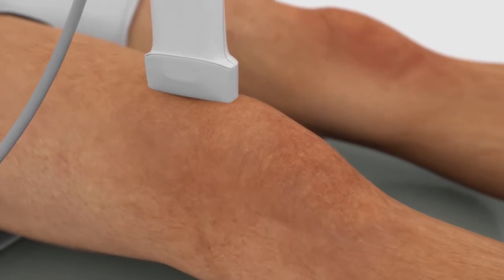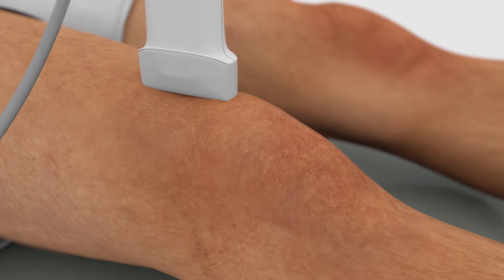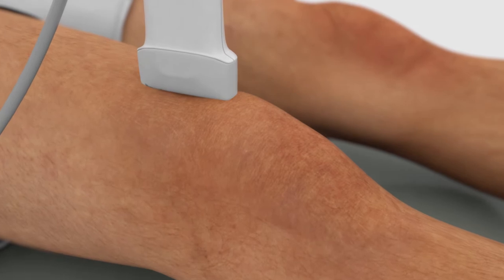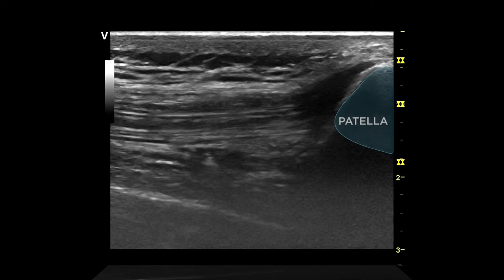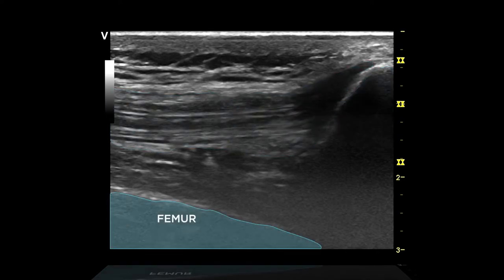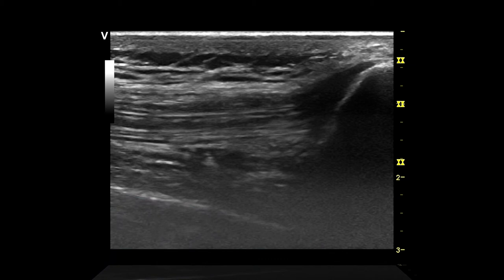With the probe marker pointed proximally, place the probe over the proximal end of the patella. Identify the patella, quadriceps tendon, and the femur. The suprapatellar bursa typically contains just a few cc's of fluid and may not be visible.